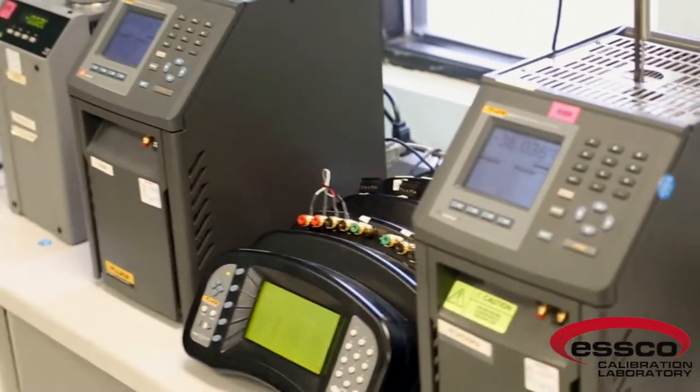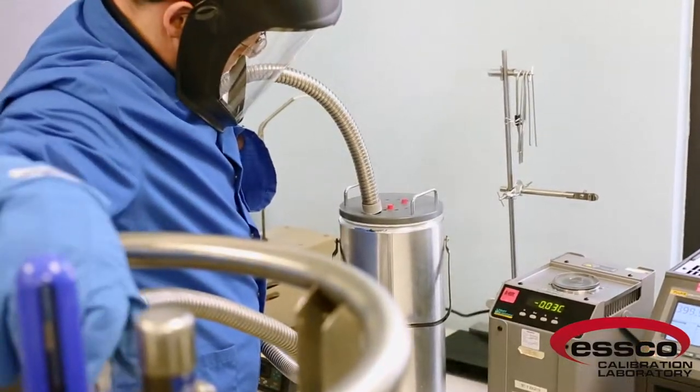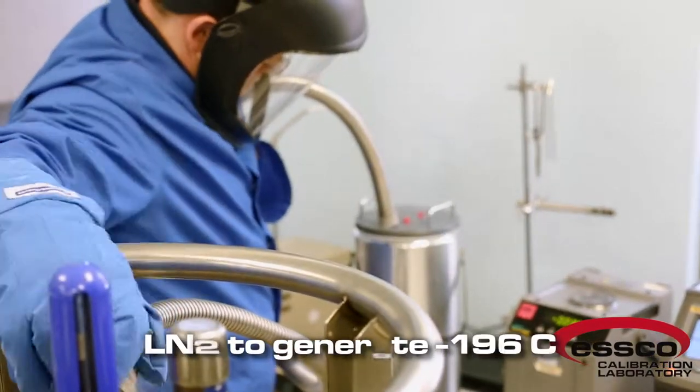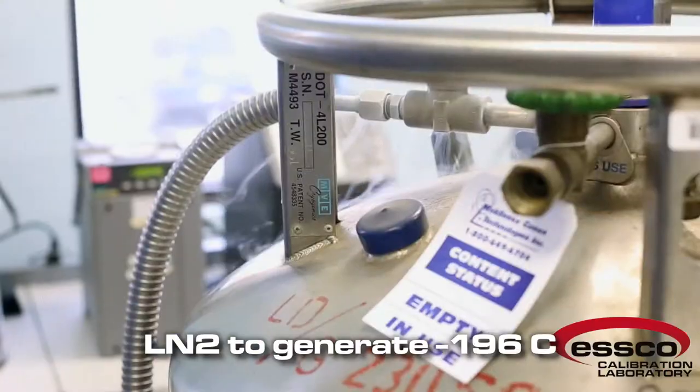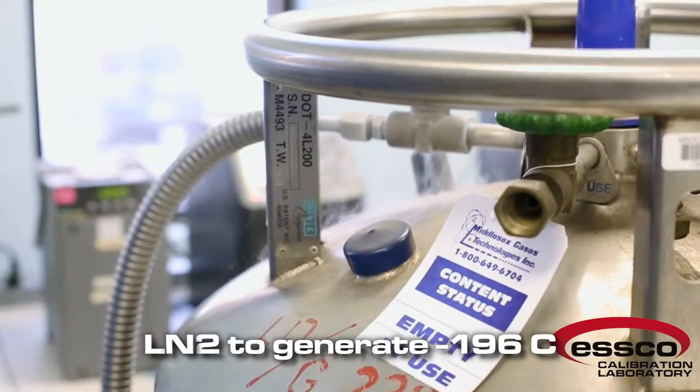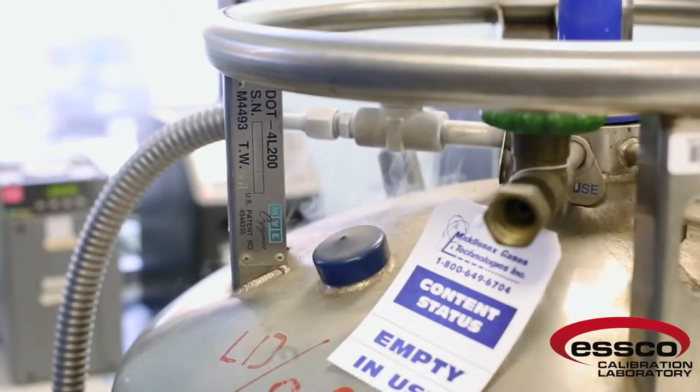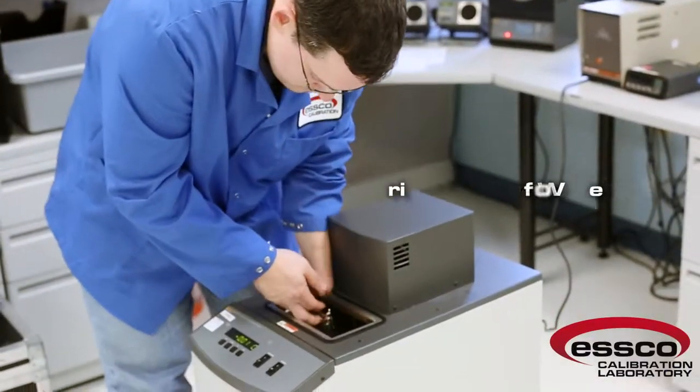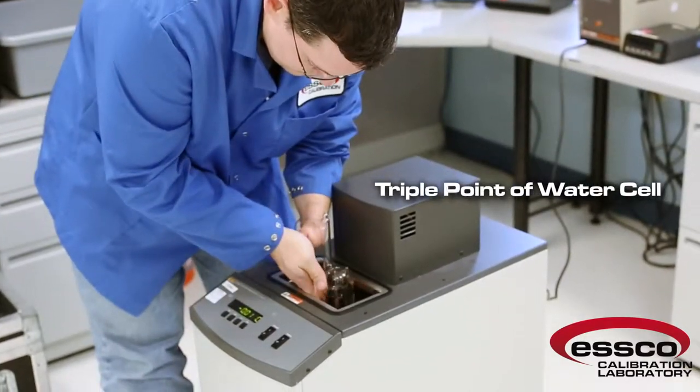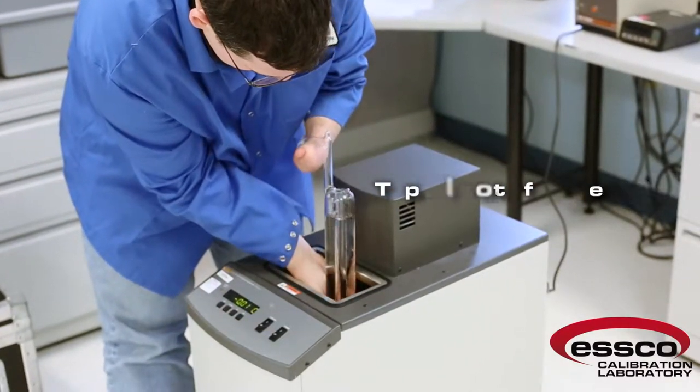Using the same standards, we also calibrate thermocouples through their effective range, or between minus 196 to 600 degrees C. We offer accredited calibrations for type J, K, and T thermocouples, and our uncertainties range from 40 to 225 mK.